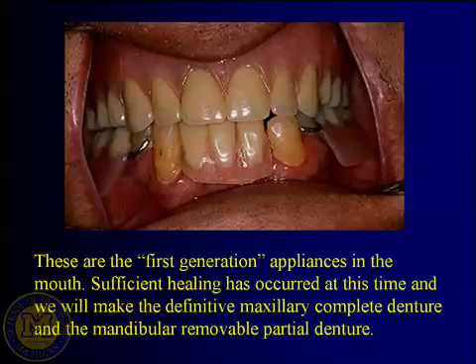And then the day that you do jaw relations, it's usually about 3 minutes to 12 or 3 minutes to 5. You come up and we say, you finally got your jaw relations, you can mount those. Patient's ready to go. I say, did you select teeth? Because now that you got the jaw relations, the next thing is to sort of set teeth.